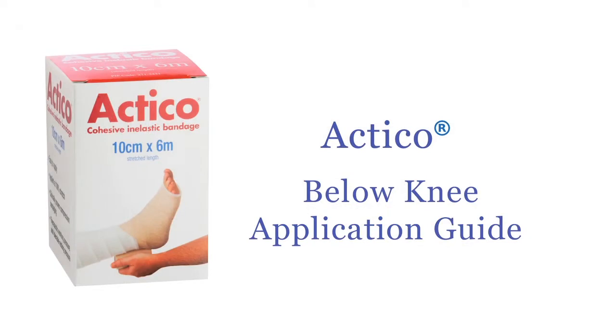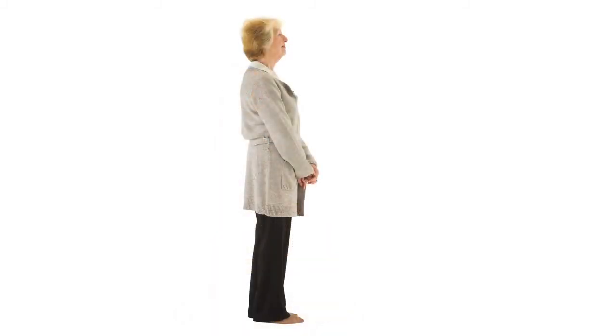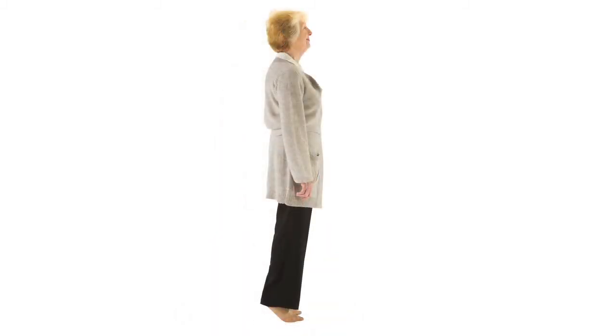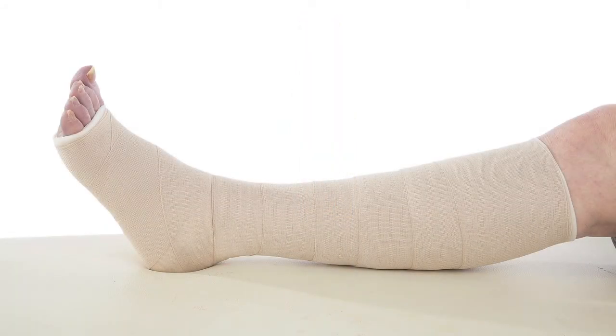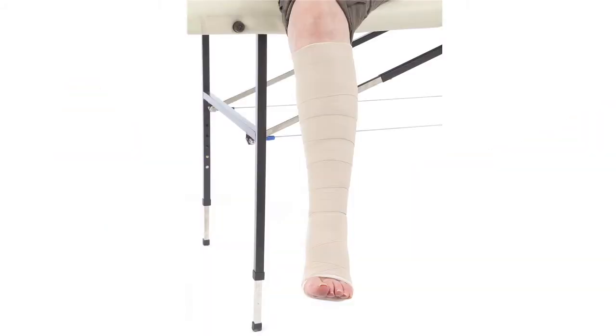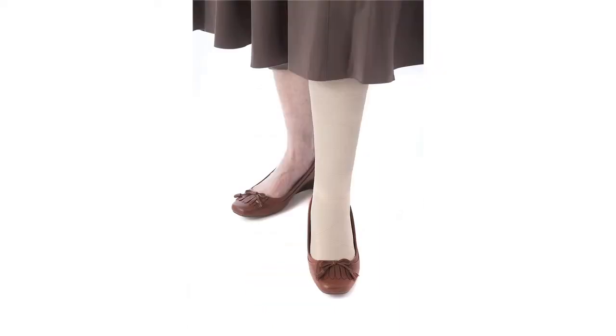Actico cohesive inelastic compression therapy works by automatically reacting to your patient's activity levels to effectively manage venous leg ulceration. Actico is a low profile system that allows patients to wear their own footwear, which in turn empowers your patient to continue with everyday routines.